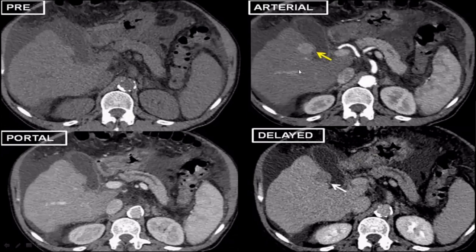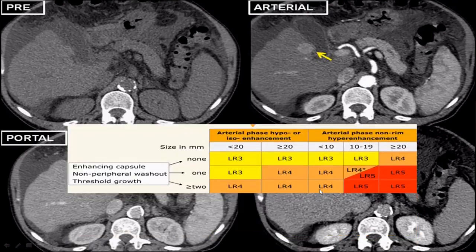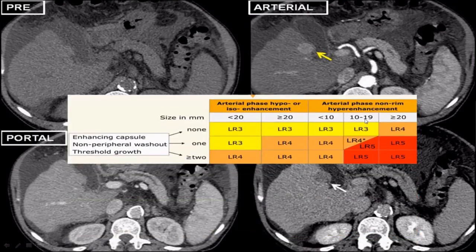This is a classical case of HCC with lesion size 10 to 19 mm. On pre-contrast images the lesion is not appreciable, but in the arterial phase it shows hyperenhancement. In the portal venous and delayed phases it shows washout — the lesion becomes hypodense to surrounding parenchyma. No capsule is seen, but washout is very evident. According to LI-RADS, this is a 10-19 mm lesion with arterial phase hyperenhancement and non-peripheral washout, categorized as LR-5.